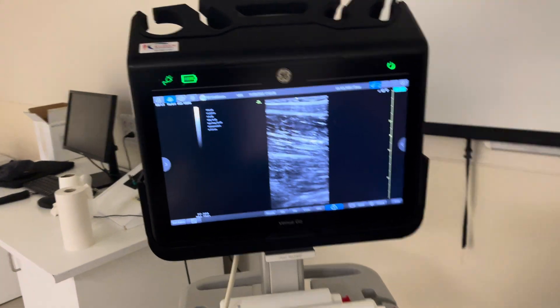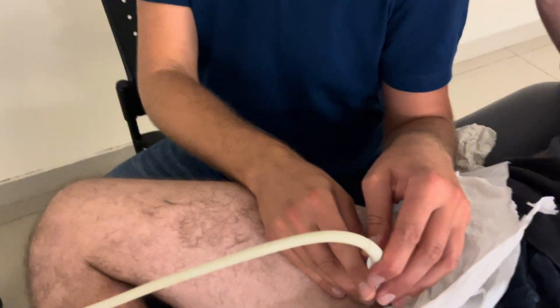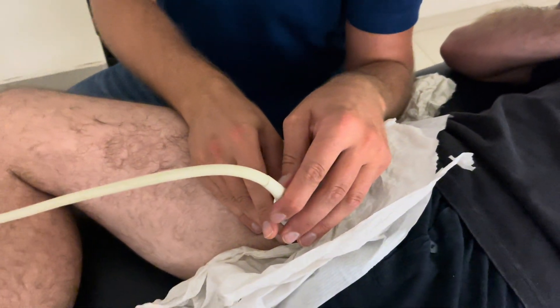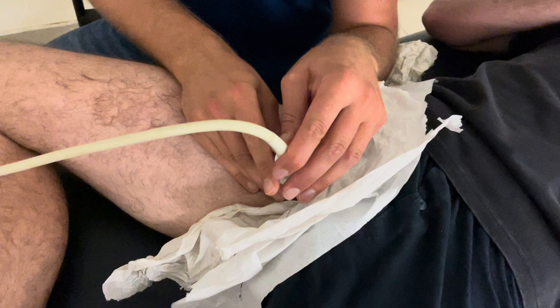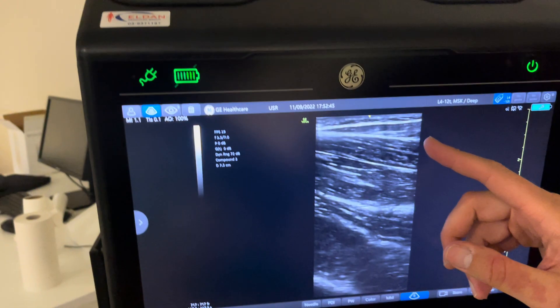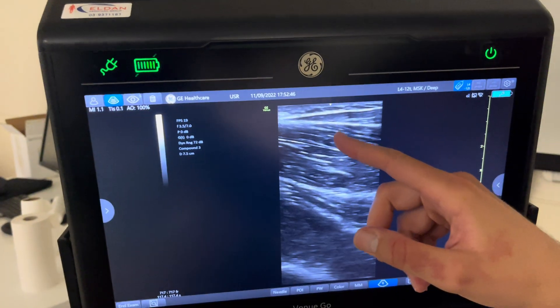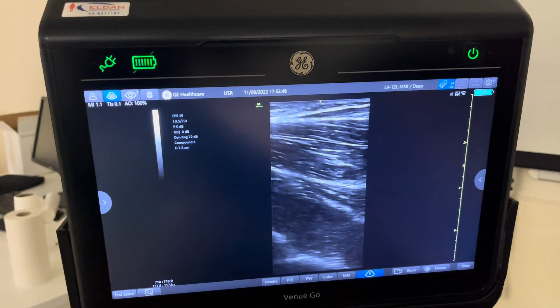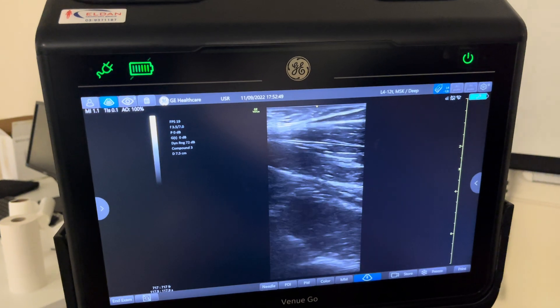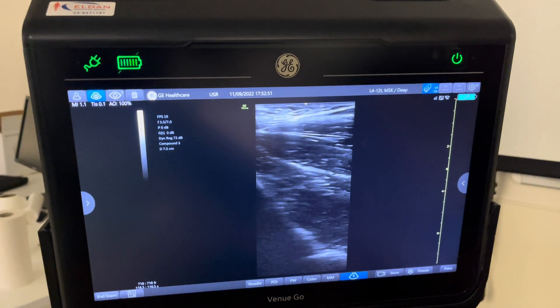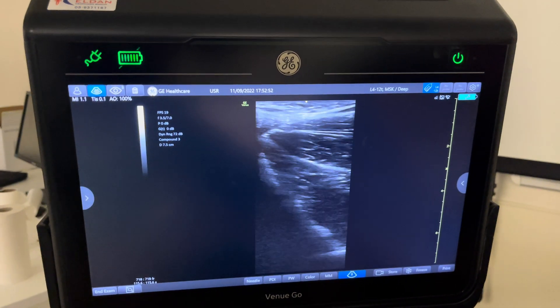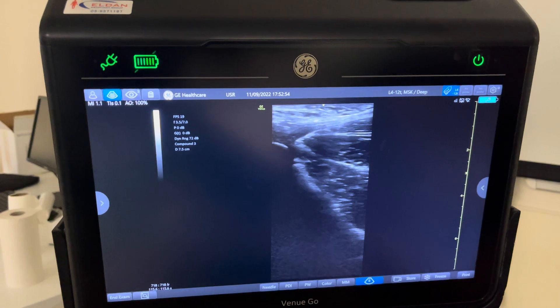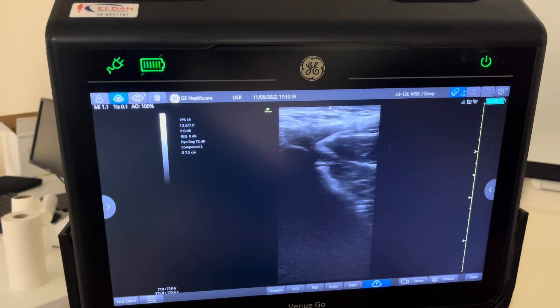Now what we're going to do is follow the structures upwards to proximal in that direction, and we're going to see what we get on the image. We keep following the central tendon of the adductor longus towards the insertion, and then we have to adjust some of the settings to get a better image.